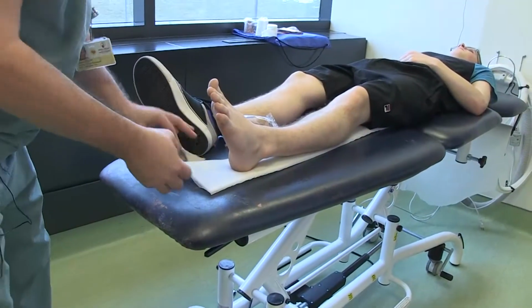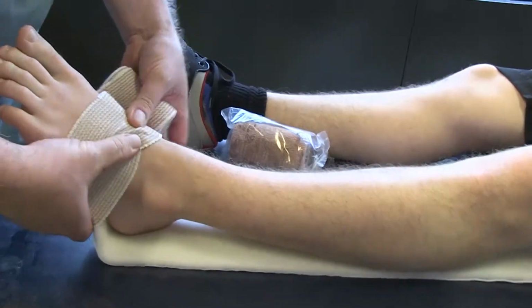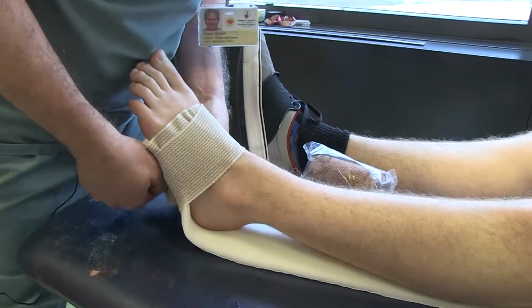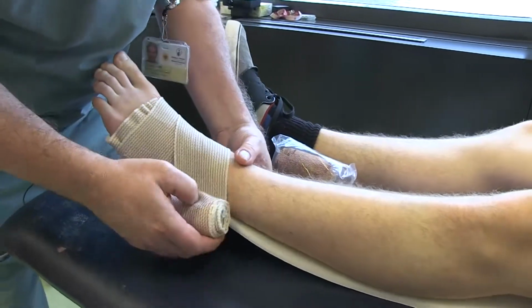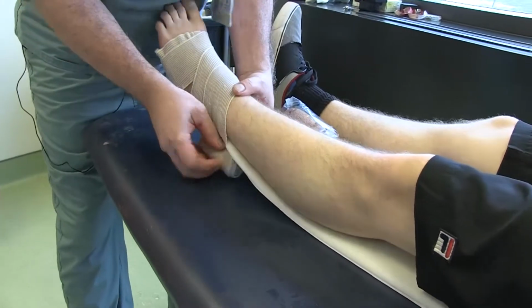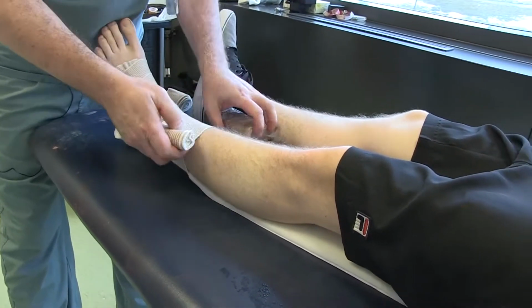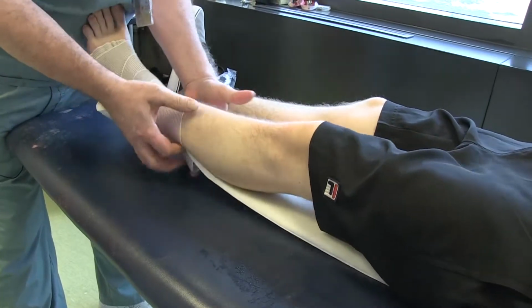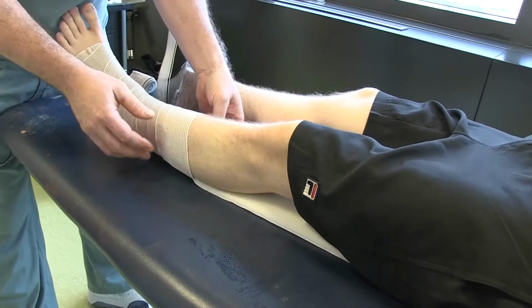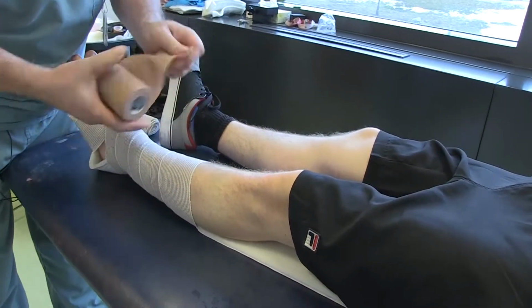So I will start rolling at the foot with the elastic bandage. So we can stop here at the toe's base. That's enough for this type of immobilization. I will never compress these sides here for the sole reason that the folds can create pressure points which will injure the patient. Now our patient is really tolerant, as you could see. But I could tell you from experience that when we roll an elastic bandage like that, the patient is in pain. It is even really painful usually. We absolutely have to immobilize the patient, otherwise it will be worse.